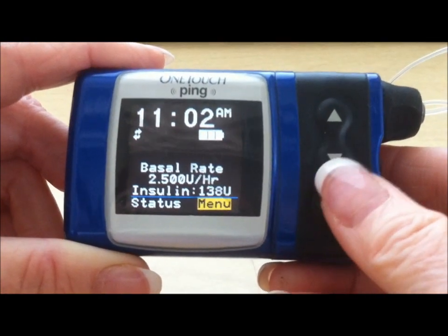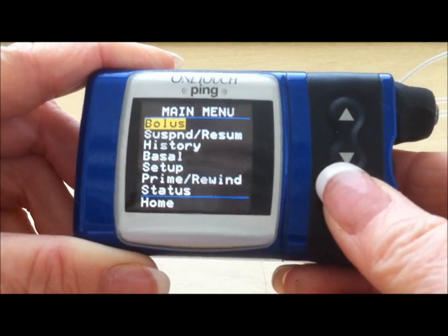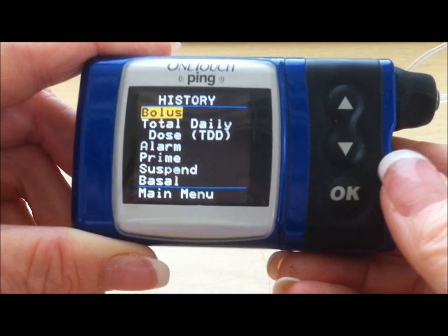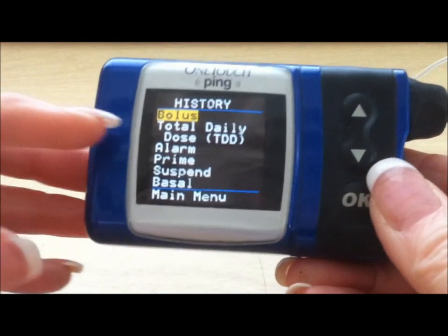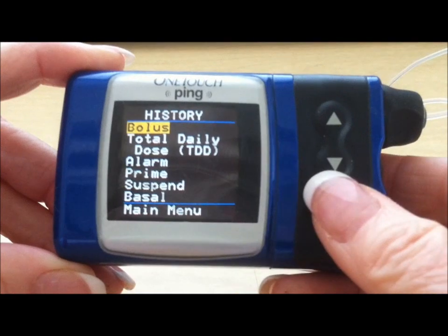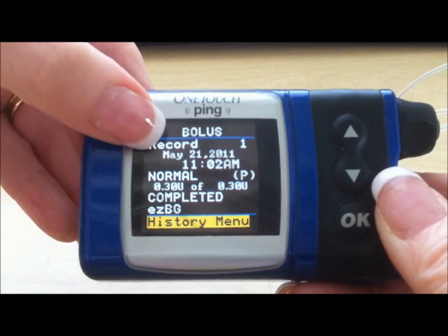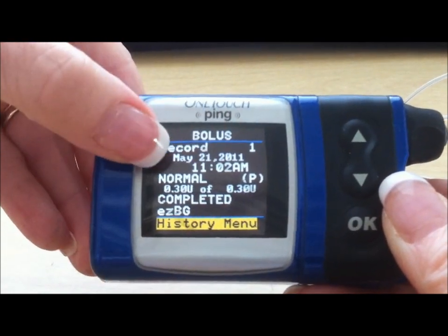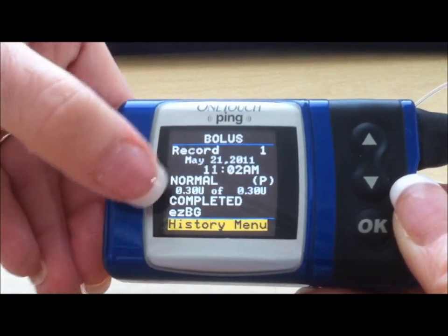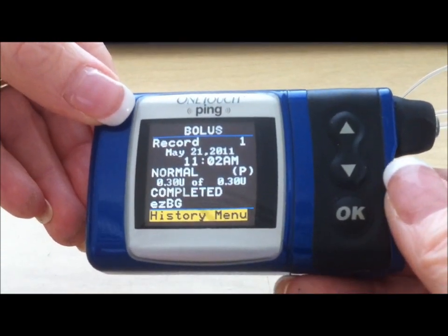It's also important to know how to check what the last delivery of insulin was. Go to your main menu and go down to the history menu. There are a number of different things you can check in history, but since bolus is what you'll be doing most often, you want to see what bolus was last delivered. Press the OK button. Record number one was on May 21st at 11:02, and it was 0.3 of 0.3 — it was completed and it was for an EZBG, so we can tell this was for an elevated blood sugar.